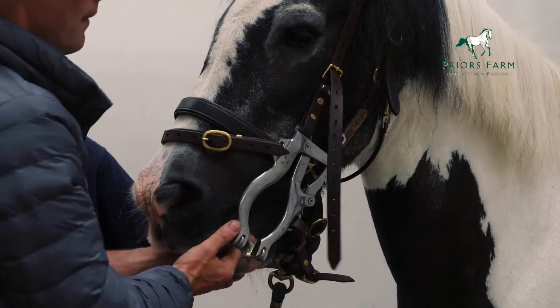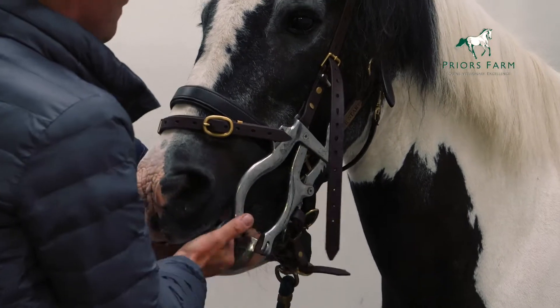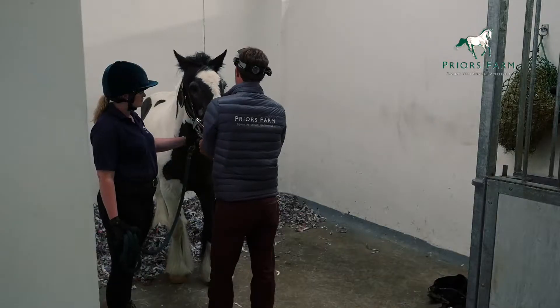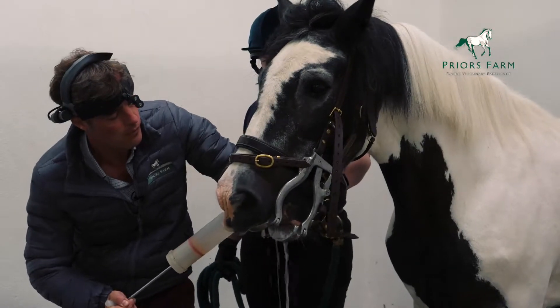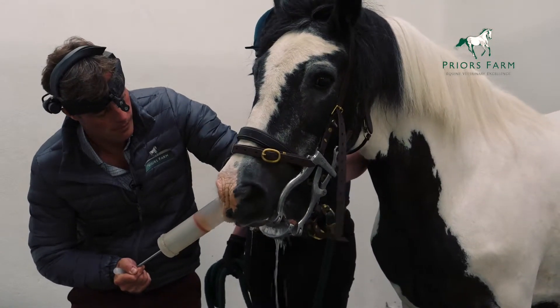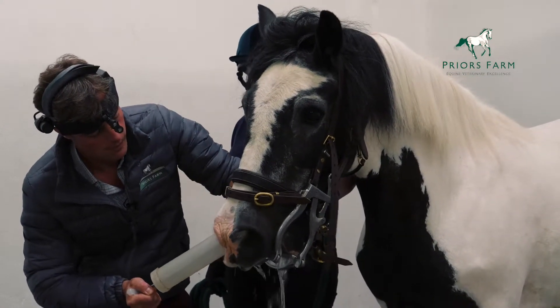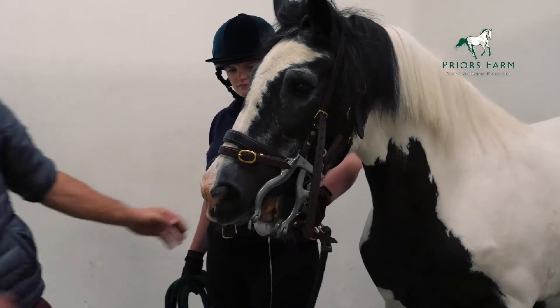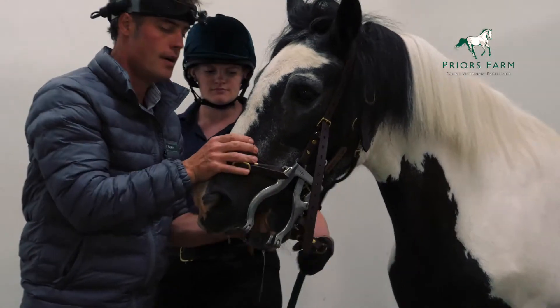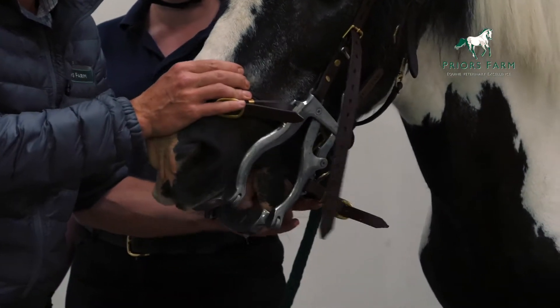We then gently open the mouth. Once the mouth is open, we can then wash the mouth out. I give the mouth a good shake — that just gets rid of any excess fluid, otherwise it goes on me.